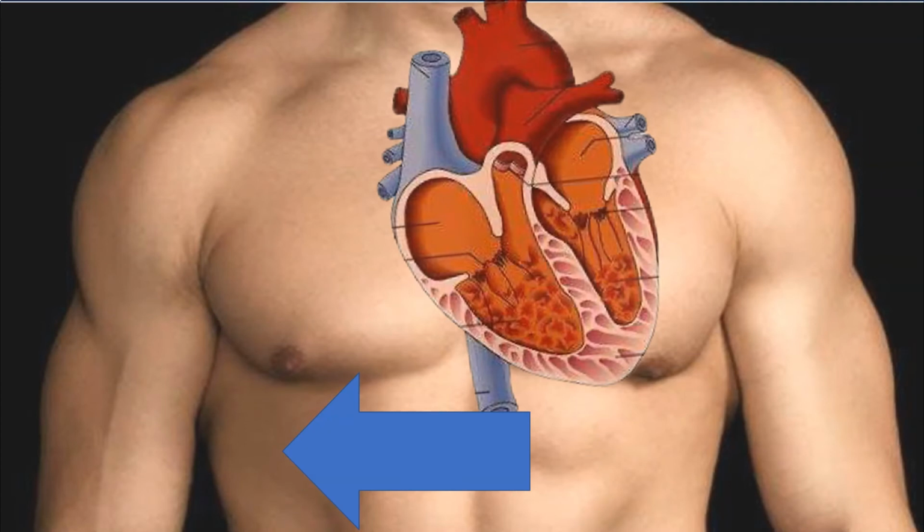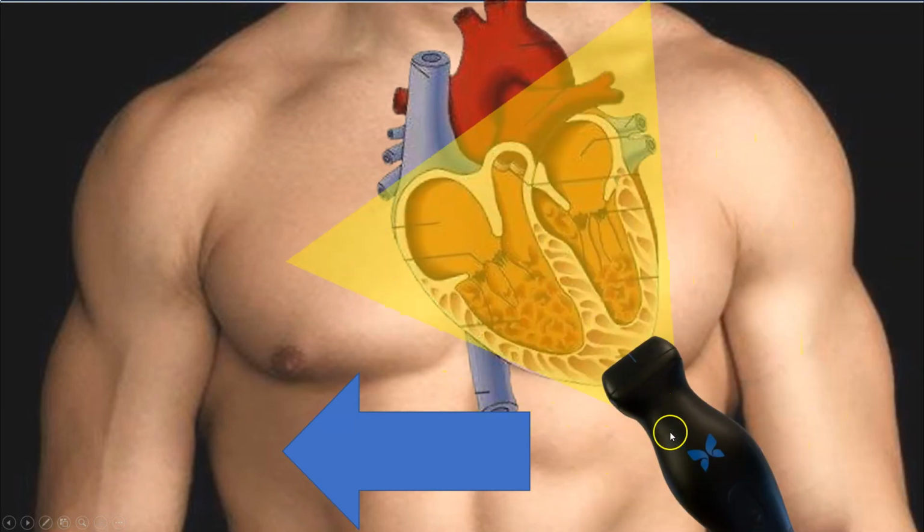Next up, we're going to move on. If you're trying to do an apical four-chambered view, this is the one that classically a lot of folks struggle with. The classic location is looking from the apex of the heart, looking up at the entire heart. So in a man, you'd basically go right under the nipple with the probe marker pointed towards patient right, and this is the way the probe would be oriented.